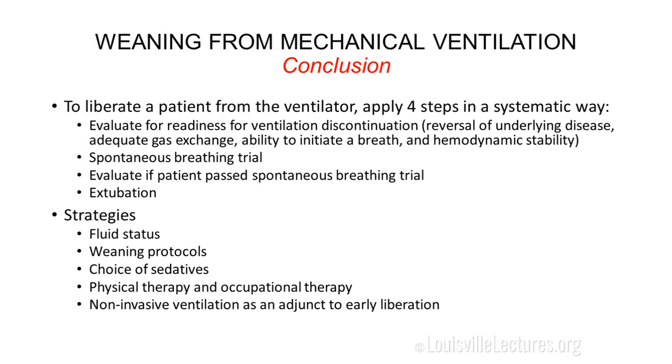Can the patient initiate a breath? So have I done a spontaneous awakening trial? And if so, has the patient gotten awake? Is the patient hemodynamically stable? Is the pressure requirement going up? Does the patient have an active MI? Does the patient have unstable arrhythmias? So this is evaluation for readiness for ventilation discontinuation.